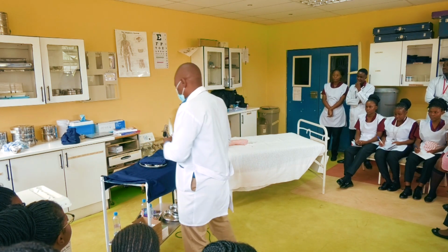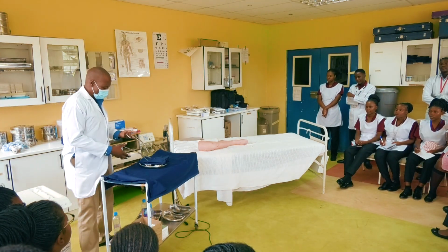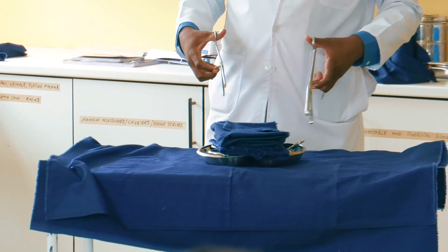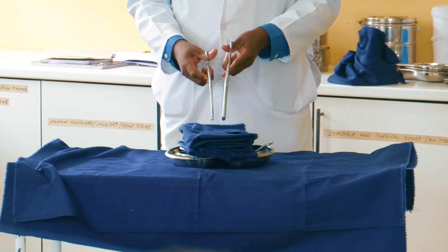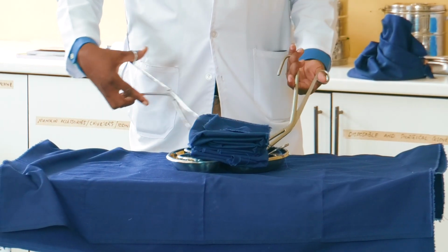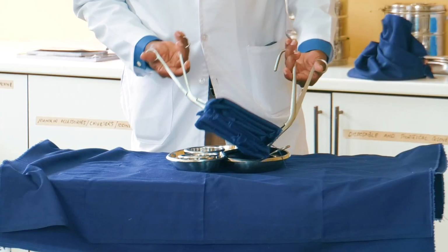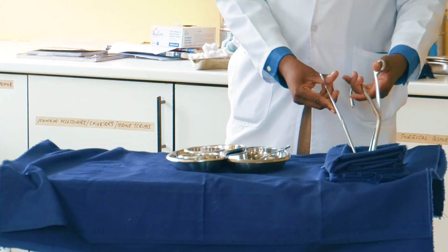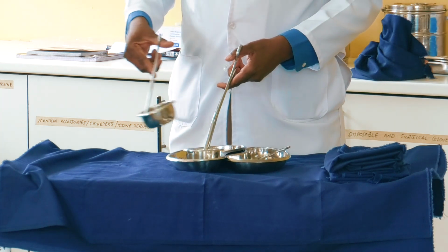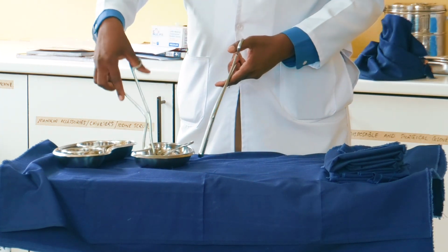Okay, I'll stand this side for the sake of demonstration, otherwise I was supposed to be this side. Start arranging this equipment, like we said. Whatever you use first, if you are the one who prepared this, you'll be confident you can put everything together this side, right? But if it was not your pack, people can pack anyhow. So the first one that we use is a drape that will cover this part, right? So these can be here, it's fine. This can be here.